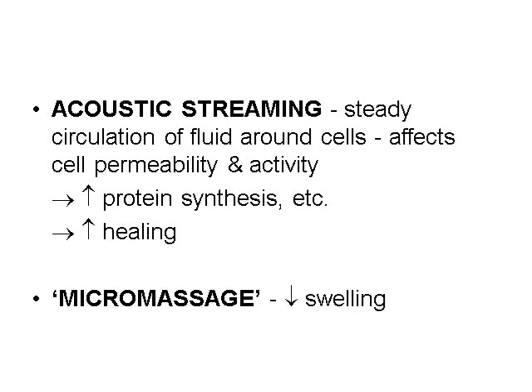Micromassage describes the mechanical effect of the sound wave on the tissues and has been reported to help reduce swelling.